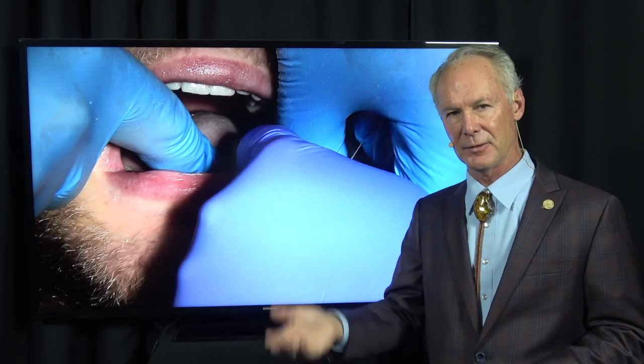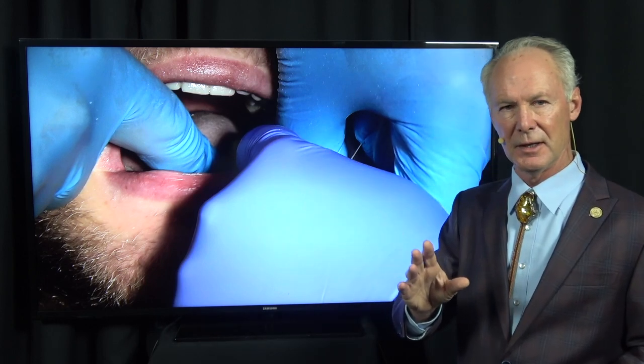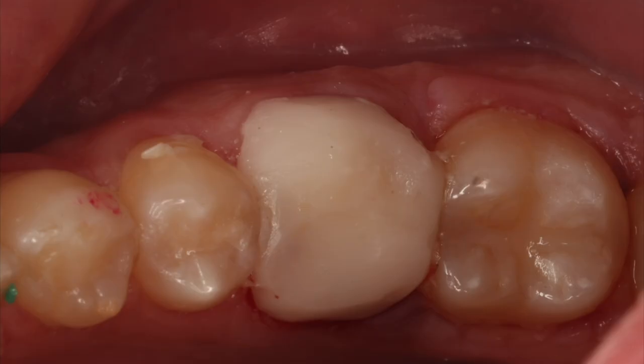I do the same thing with the final crown. I floss with waxed floss before the provisional cement or the permanent cement sets, so it doesn't set up in the interproximal area. I don't remove any excess cement though until it has set completely. Not rock hard, but just set, kind of like crunchy snow.